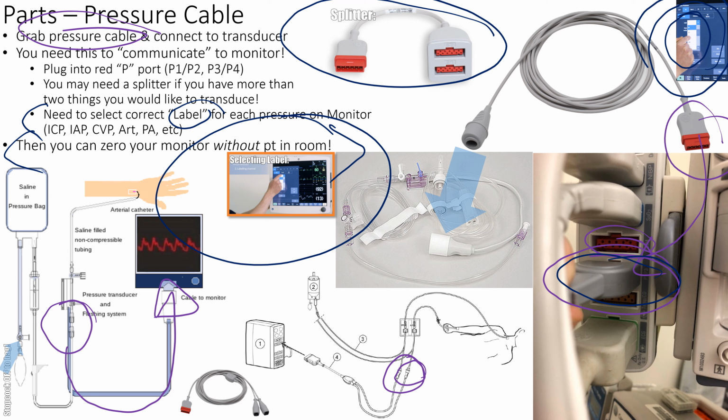Okay. So that's the idea behind the pressure cable. Let's plug it in where, right? If you look at the transducer, you follow it back. One is going to the pressure bag, and one is going to a little port where you can plug in your pressure cable.